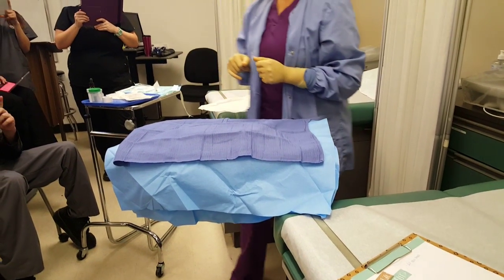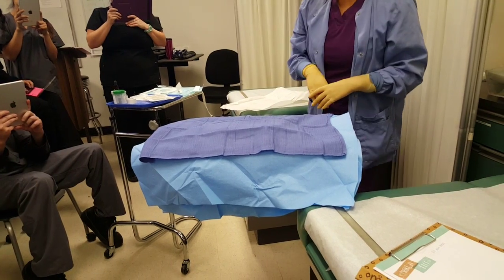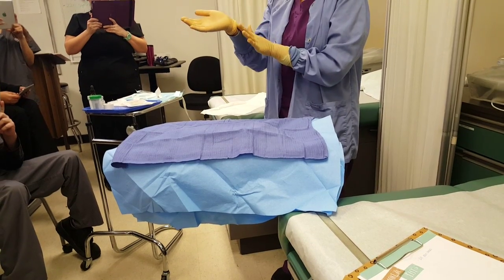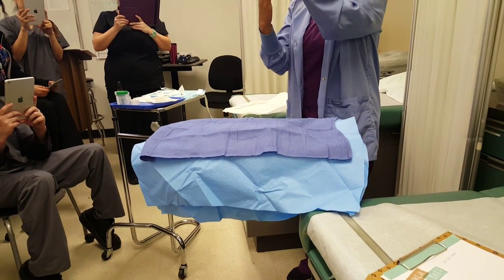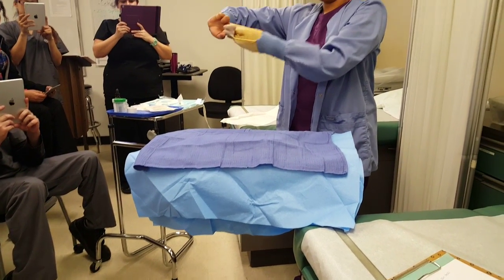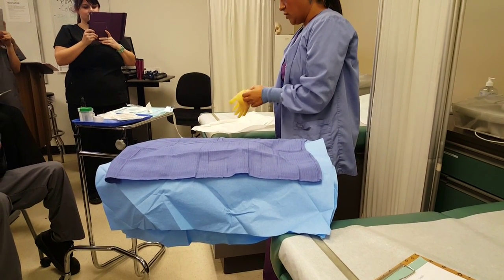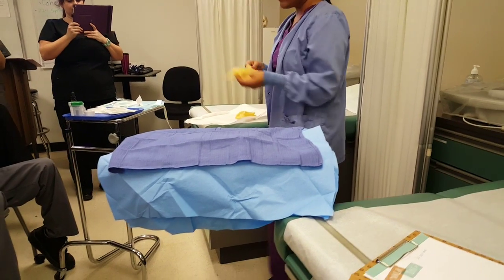This is step one. Now I remove my gloves. When removing soiled gloves, you always start from the cuff. Take all of it — any blood stays in there. Gather it with your other hand, bunch it up, then grab the other glove from the inside and everything stays inside. These gloves are now wasted and would not be reused in a real clinical setting.